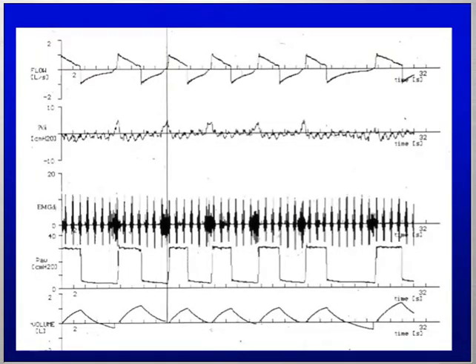This is an example, again, to show that it can happen even with a mode you think it's very simple to use, like pressure support. You see the diaphragmatic EMG and you see the airway pressure tracing. It looks very nice, very regular. However, if you look carefully at every small EMG activity, this corresponds to very small transdiaphragmatic pressure activity.